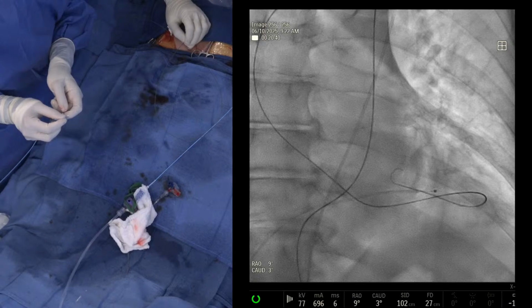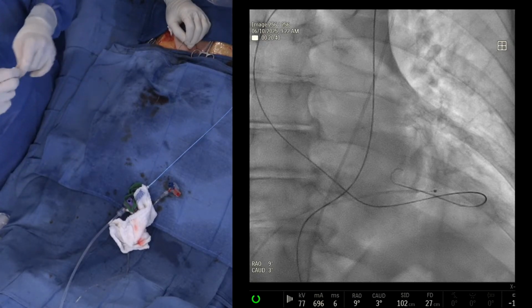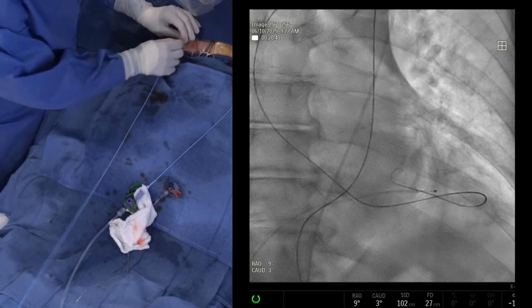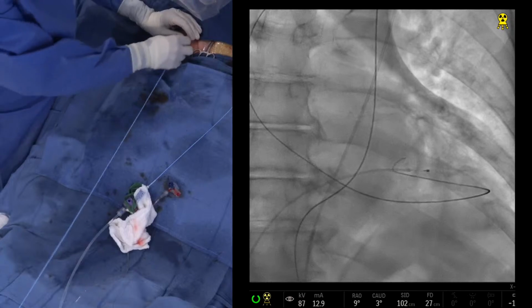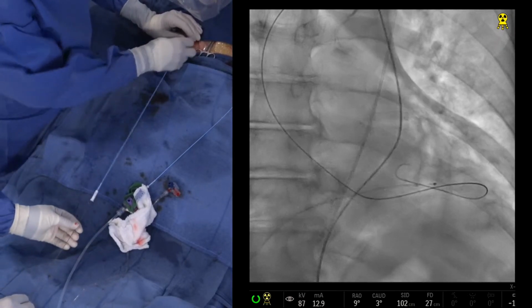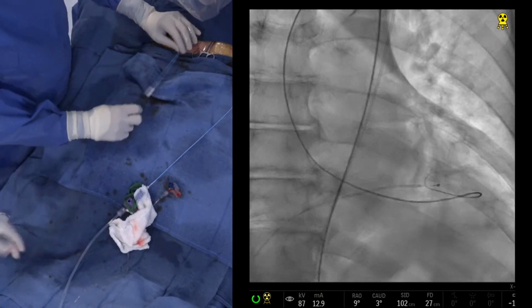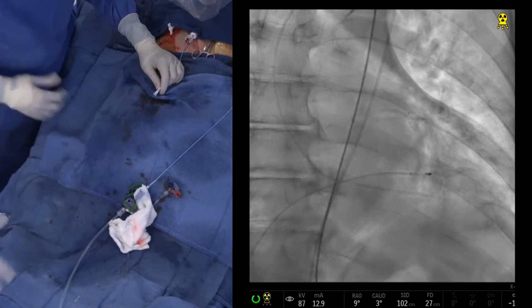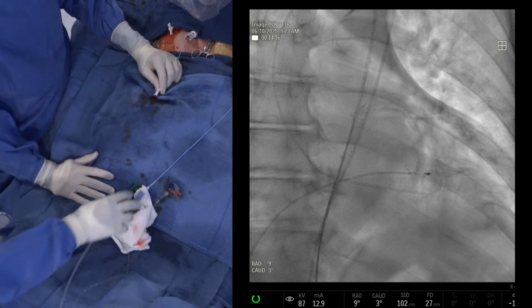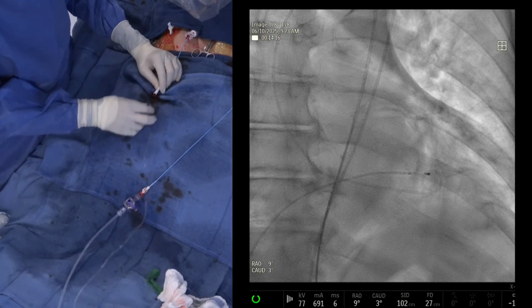I think more studies have come up and shown that in the current day and age, you just give maybe IV cangrelor during the procedure and use clopidogrel, and it does not increase the vascular bleeding at present. And of course we are using closure devices and very meticulous vascular technique, so that's less of an issue. I think more, in my opinion, it is the practice pattern and the reimbursement pattern, because you can use multiple stents, multiple devices, and then you do a TAVR and the reimbursement is not appropriate.